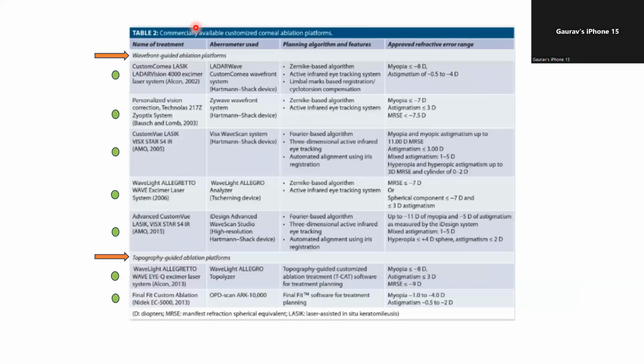So, Pranav, what is the disadvantage of wavefront guided treatment? One of the main disadvantages. You've told the limitations, but I'm asking about the disadvantage. Sir, the wavefront data that we acquire is not entirely accurate because we are compensating for the lenticular and the internal astigmatism of the eye as well, which is dynamic, as I mentioned.